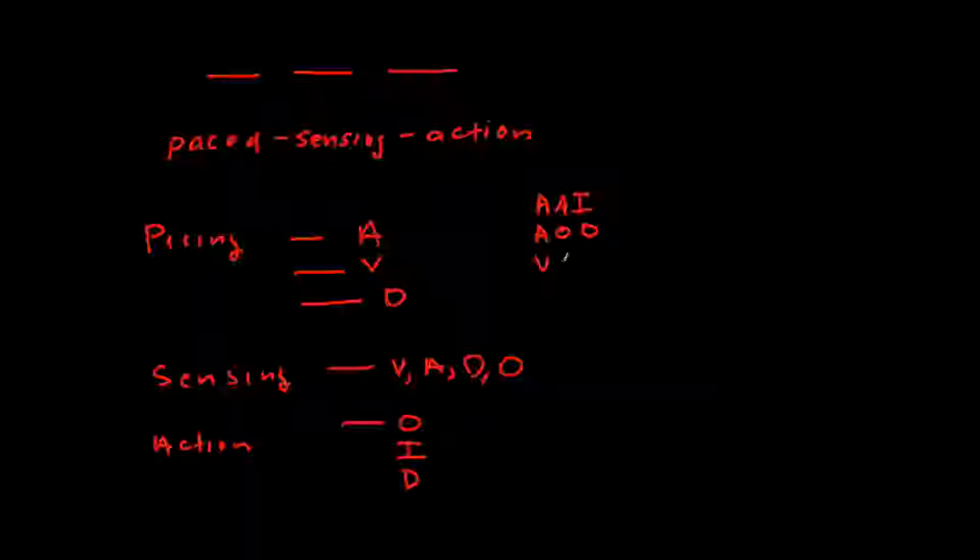You can have ventricular analogs, VVI and VOO. Sometimes the inhibitory, when you have like sensing and inhibition, this is sometimes called demand pacing, which means if there is nothing going on, then the pacer will pace on demand. And situations like AOO or VOO and DOO, where you're just pacing, period, and you're not trying to sense anything, and you're not going to do anything because you're not sensing anything. This is also called asynchronous pacing.